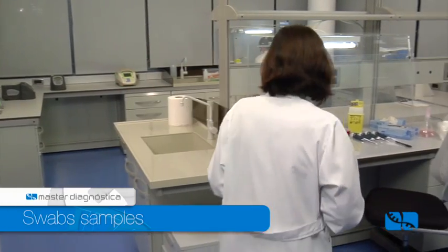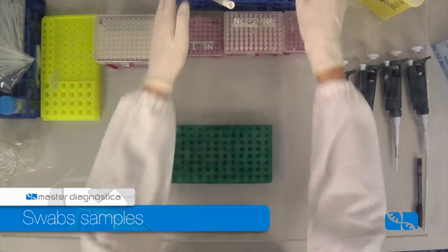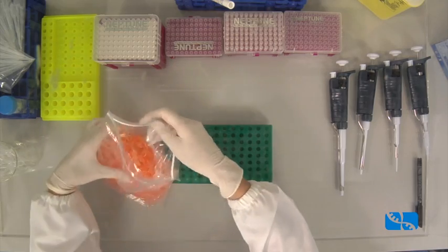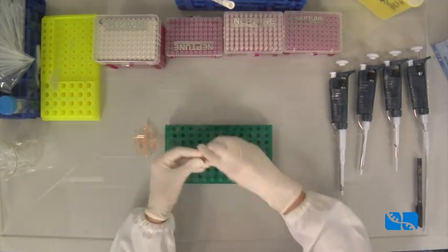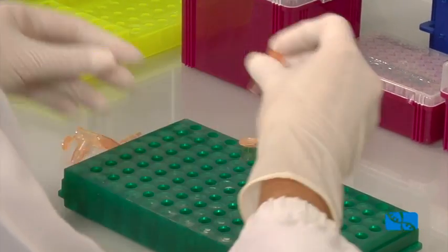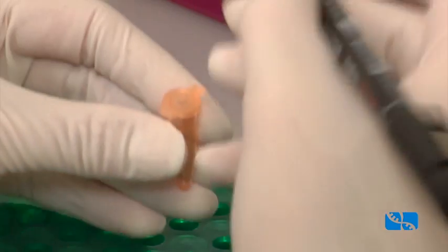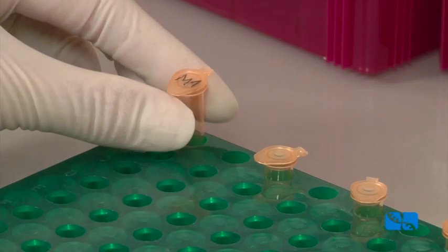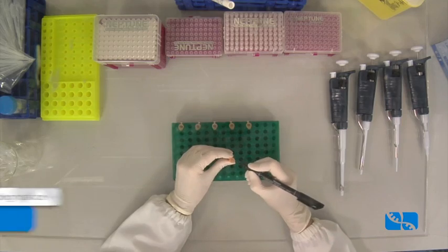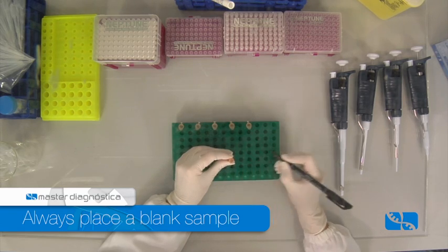Take swab samples out of the refrigerator and place them inside the hood. Prepare Eppendorf tubes according to the number of samples that are going to be processed and label them. There must be a tube for a blank in each run, containing all reagents used along the process apart from DNA.